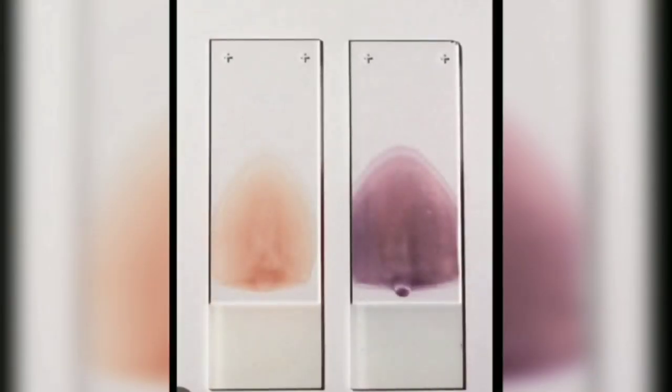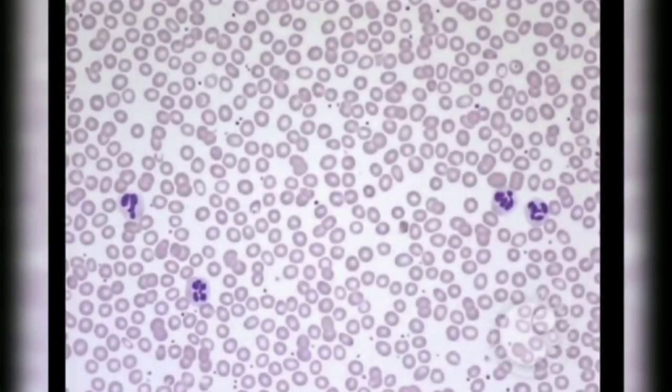These three help in solving the puzzle of anemia: red cell distribution width, mean cell volume, and peripheral blood smear. Yes, mark my word, peripheral blood smear gives us additional paramount information as well as helps in confirming our initial interpretation. So it should be ordered as a priority investigation in case any abnormality is noted in CBC.